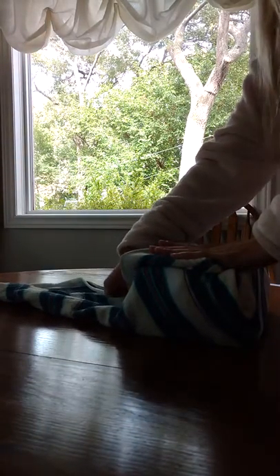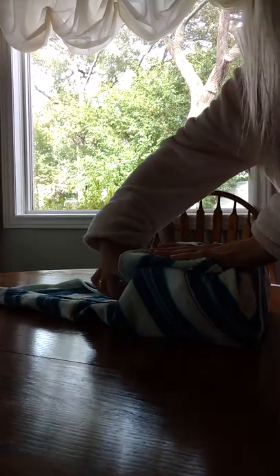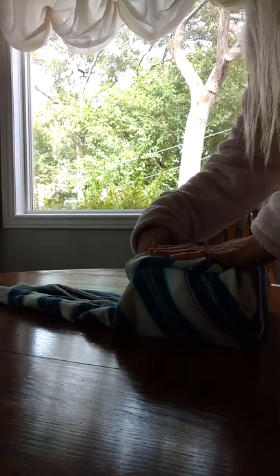Again, just creating that little fold. Keep the corners tight. Bring over the right side and create a tab. Kind of make a nice fold there as well. Bring the top up.